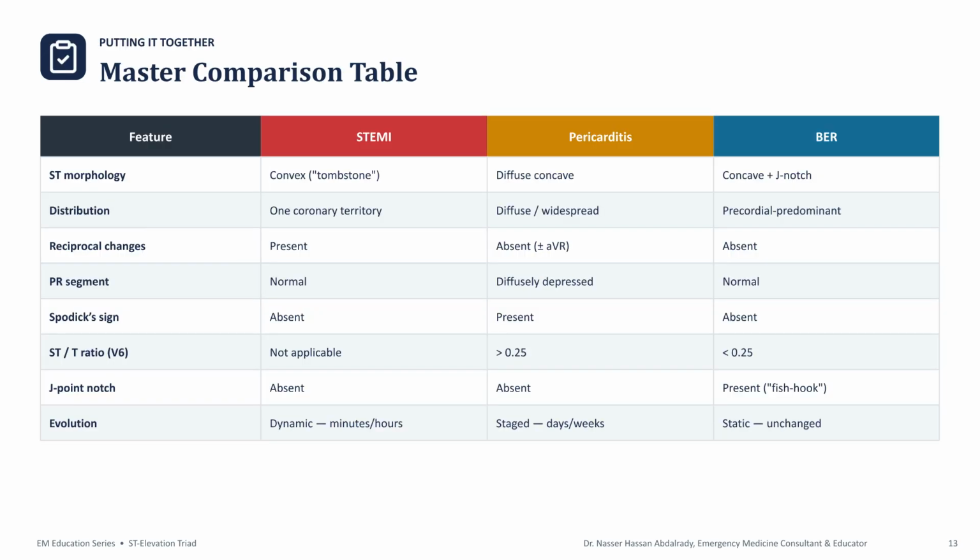Here is our master comparison table summarizing these features. You can use this as a quick reference when assessing your patients. Keep this guide handy to help distinguish these three patterns effectively.